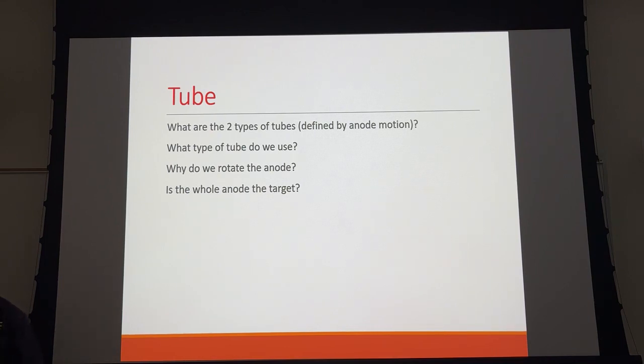They now use, anybody been to a dentist's office who uses a little gun X-ray tube? That is so fascinating to me. They just got this little self-contained X-ray unit that they just pick up, and it looks like something off of a sci-fi movie, and they stick it up next to your face and zap you with it. It's digital, so they put a digital image receptor in your mouth and zing you with it. It's pretty wild. So inside this little thing, you've got everything that we use to make a high voltage X-ray beam, but it's all contained inside this one little gun. It's not little, it's kind of big, but compared to what we use, it's pretty small.